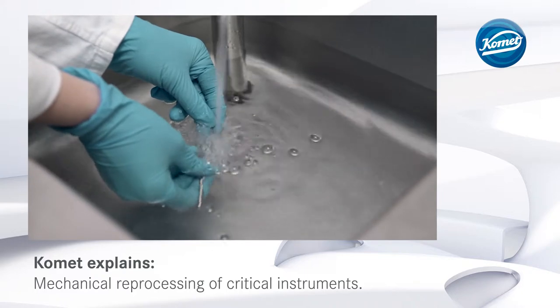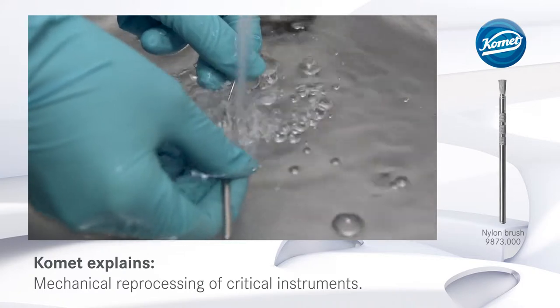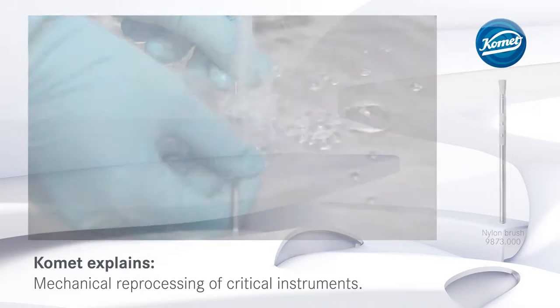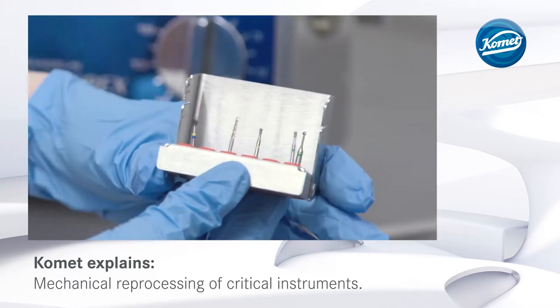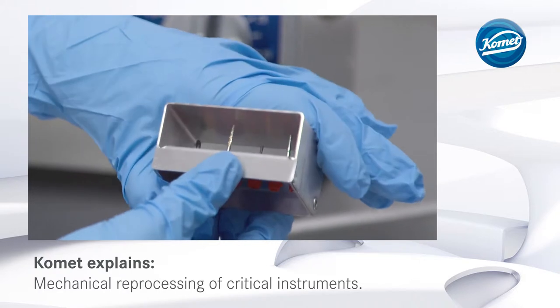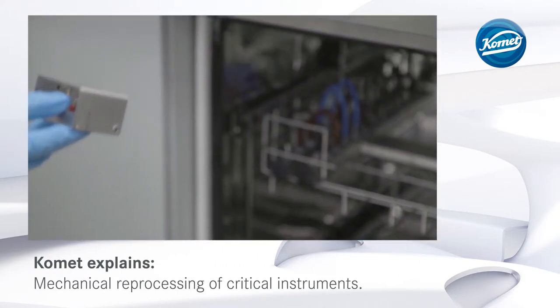Once the pre-cleaning step has been concluded, the rotary instruments are thoroughly rinsed under running, demineralized water. After that, they are placed into a suitable burr block for neat storage during reprocessing. This also prevents the rotary instruments from coming into contact with each other and holds them safely in place during the process.